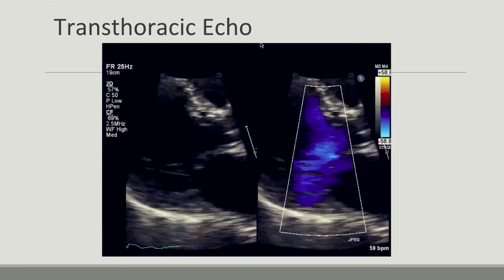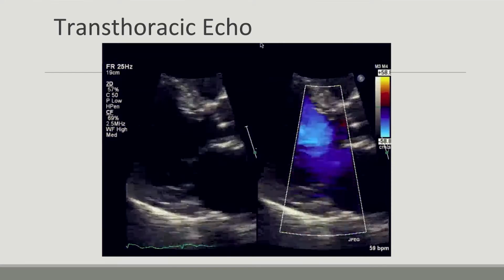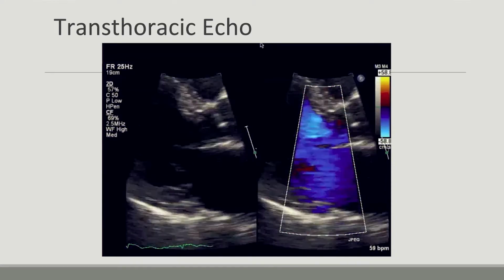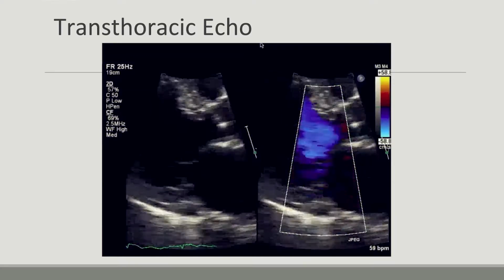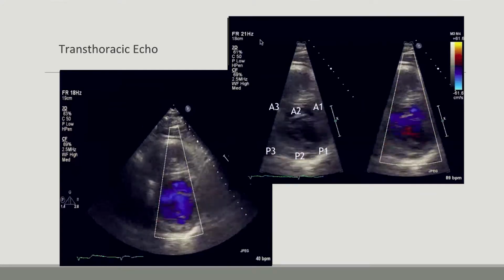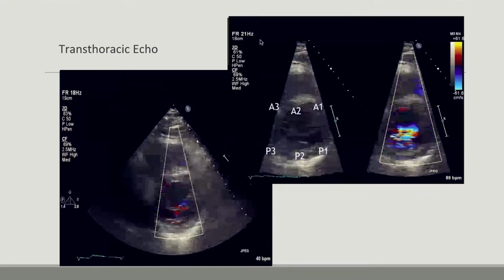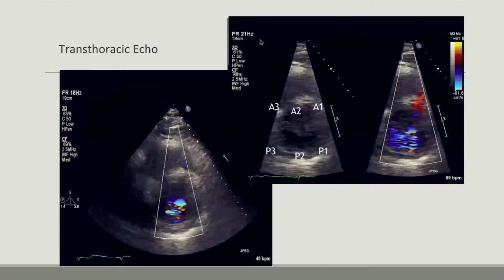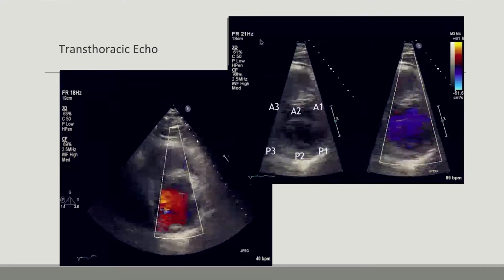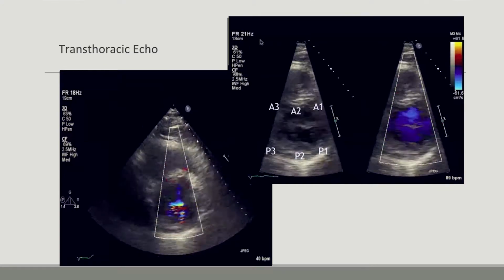The color of the mitral valve in the long axis gives us a first look at the severity and the direction of the jet. We can see this is eccentric and directed posteriorly. The short axis is a very important and sometimes forgotten view when evaluating mitral regurgitation. This is the first view we can identify the origin of the jet and also the jet width. We can see this jet is pretty central, arising from A2P2, but the jet is also pretty wide.